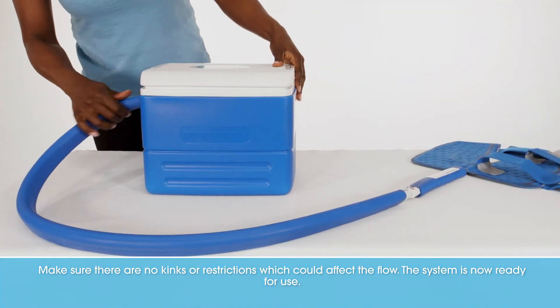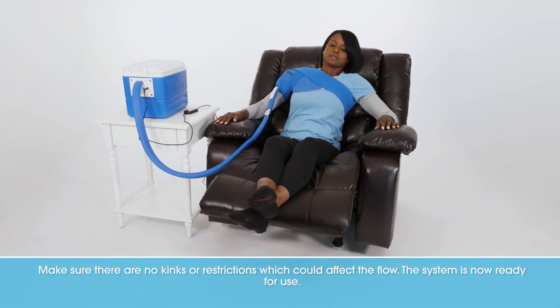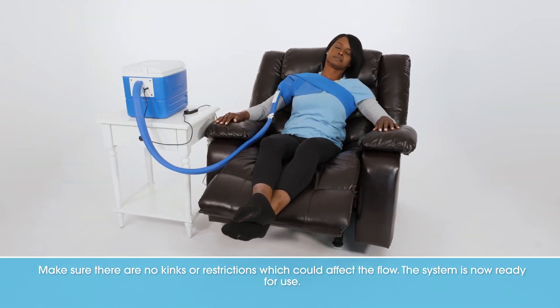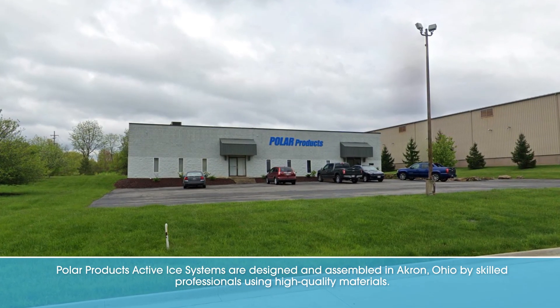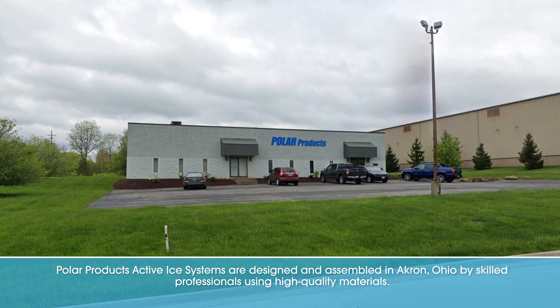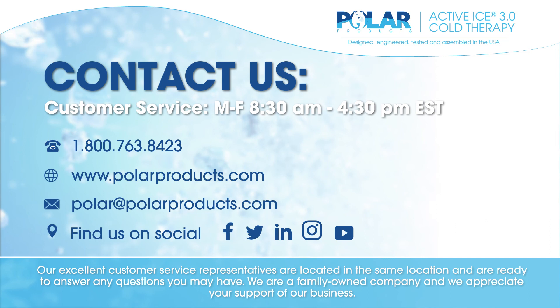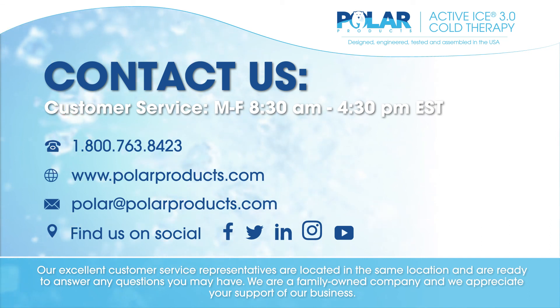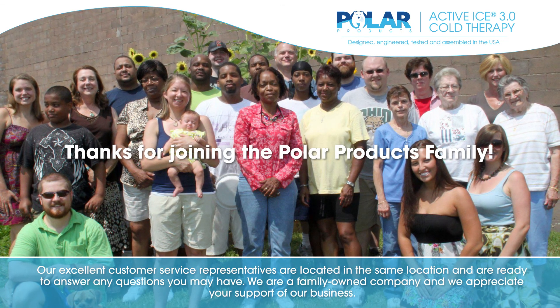Make sure there are no kinks or restrictions which could affect the flow. The system is now ready for use. Polar Products' Active Ice Systems are designed and assembled in Akron, Ohio by skilled professionals using high-quality materials. Our excellent customer service representatives are located in the same location and are ready to answer any questions you may have. We are a family-owned company and we appreciate your support of our business.